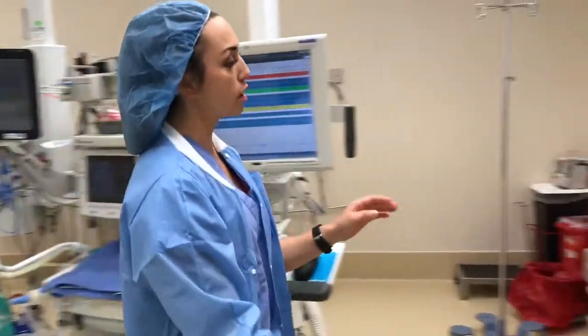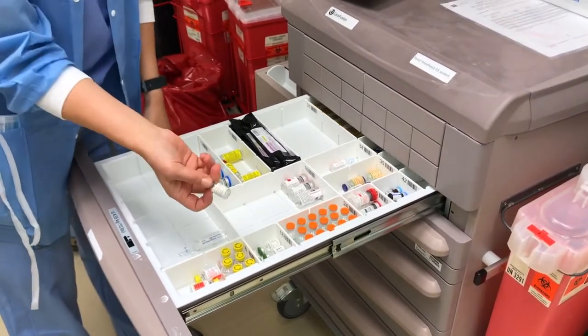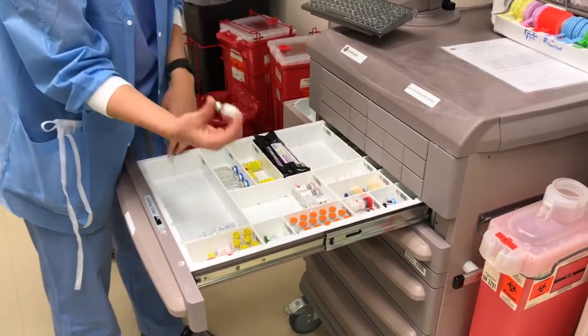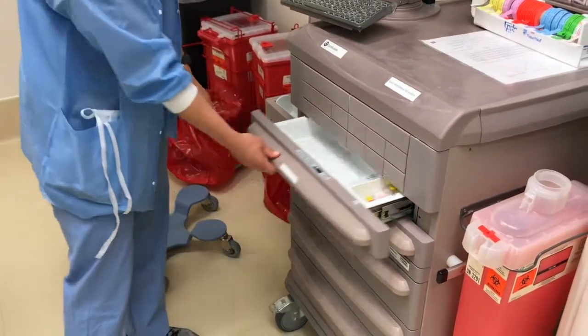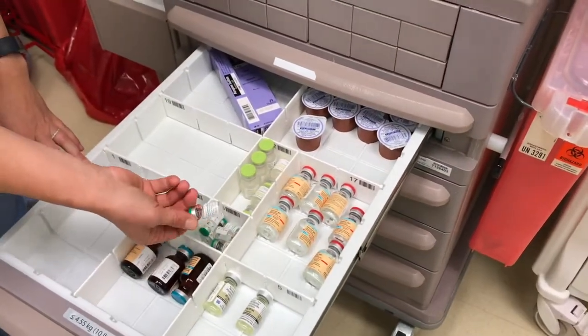All right, so for drugs, usually starting with the top drawer, you've got your Zofran. Sometimes they'll give it to the patients in pre-op. They'll give the disintegrating tablet, but sometimes they won't. But if you need it, that's the top drawer. You also have ephedrine. You may have to use some ephedrine. And then here's your Bicitra. And then you've got Reglan right here.